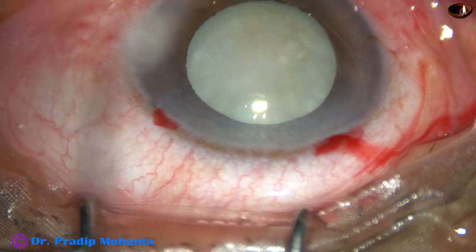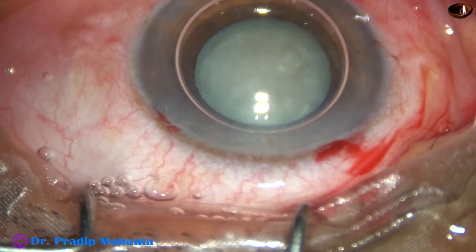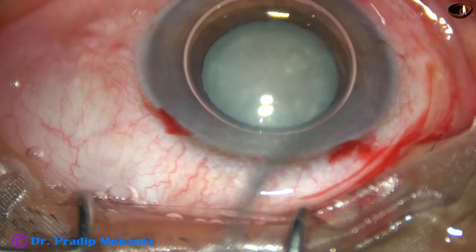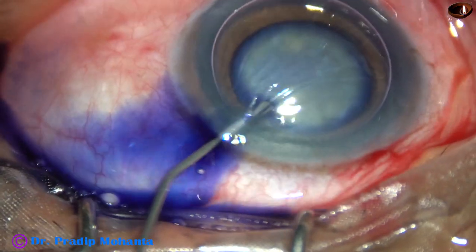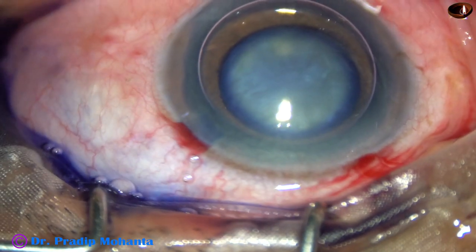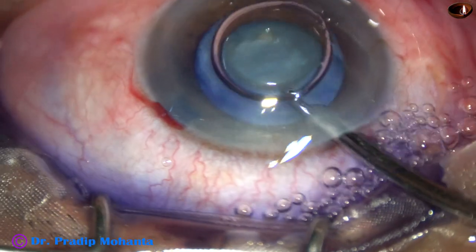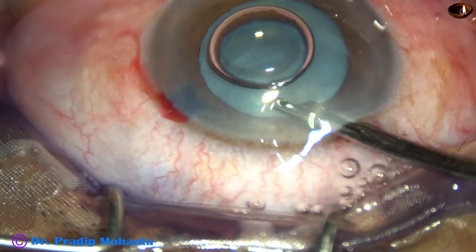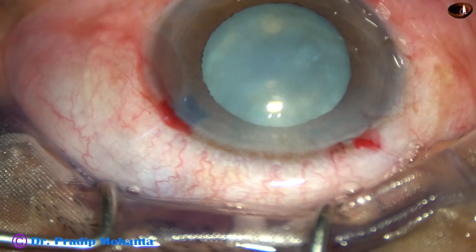In this case, I want to stain the capsule with trypan blue dye. Here is an air bubble. Beneath this air bubble, trypan blue 0.06% dye is applied over the anterior capsule. And after a few seconds, the dye is washed out. When we stain underneath an air bubble, the staining is immediate.